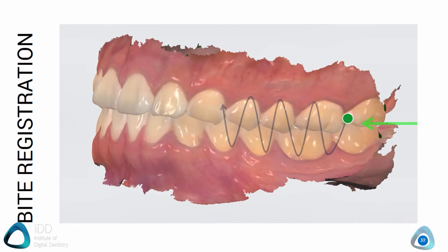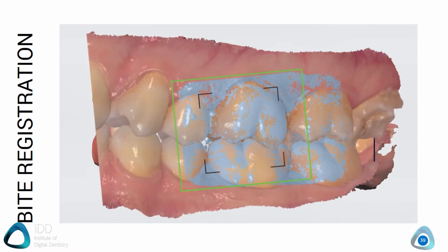Start the bite registration scan and in a zigzag pattern slowly move the scanner to the front, while also tilting the scanner up and down to capture aspects of both the top and bottom buccal gingiva. Once the scan is aligned, the software will let you know — typically by aligning the two arches in real time together. Once your bite registration is done, you have successfully finished your full arch scans.